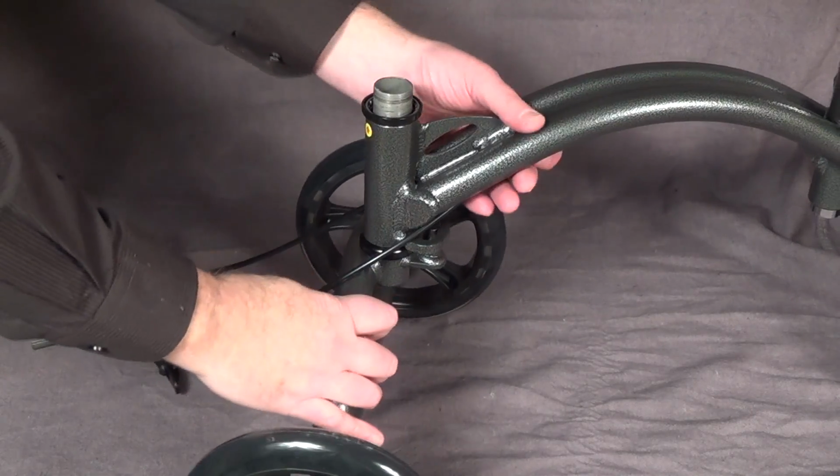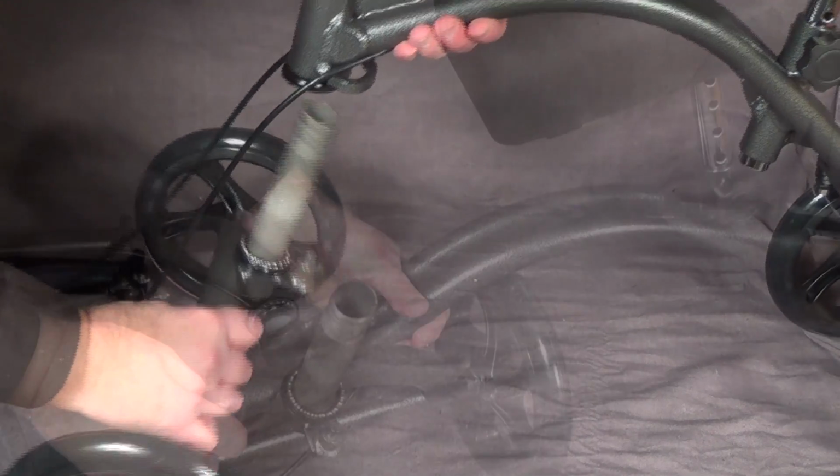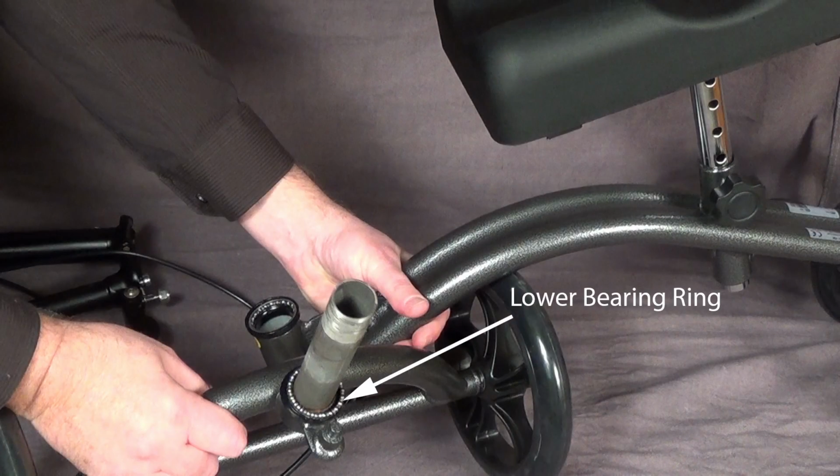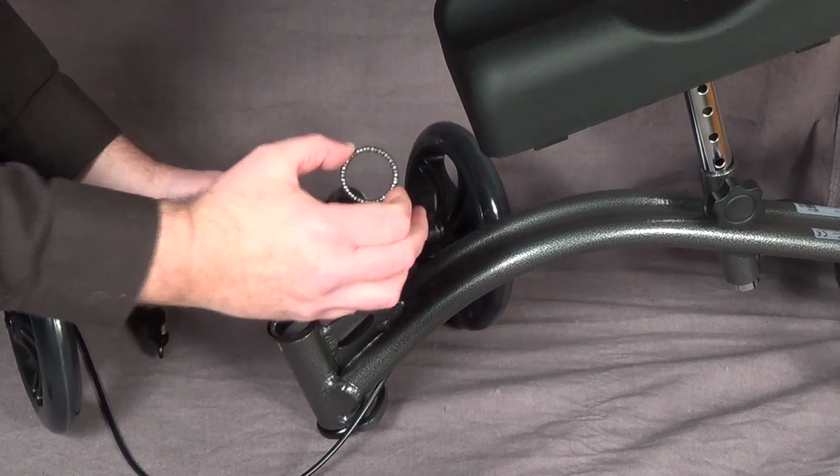Remove the steering fork from the frame. Make sure you keep the bearing rings. Remove the bearing ring from the steering fork.